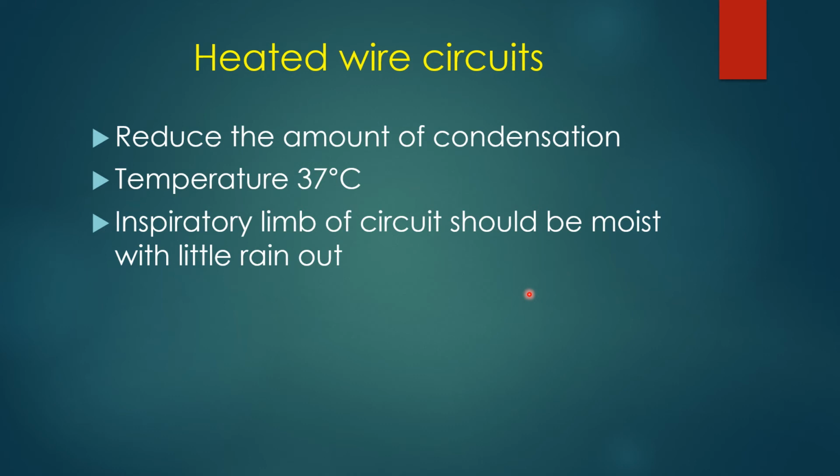Now, another problem is you have the heated wire circuit, and you see a lot of water sloshing around in there. Well, then again, you need to adjust the chamber temperature on your humidifier. Don't think that you should have a dry circuit. People that think that run the risk of having severe problems happen to your patient.